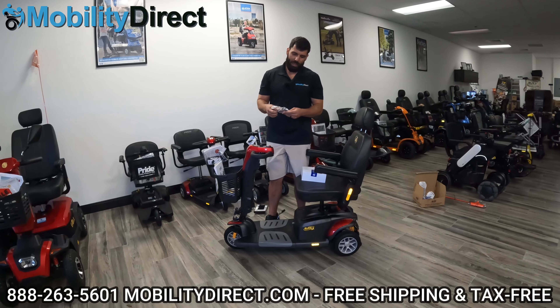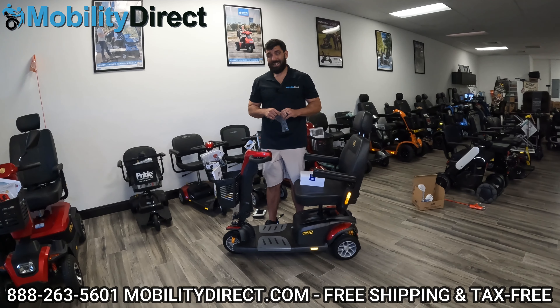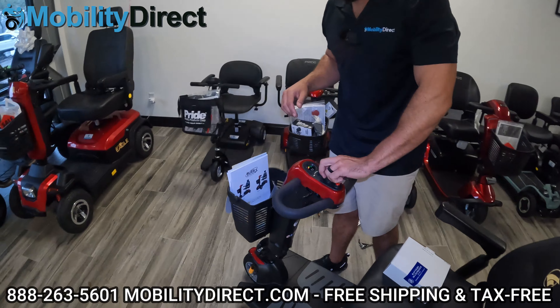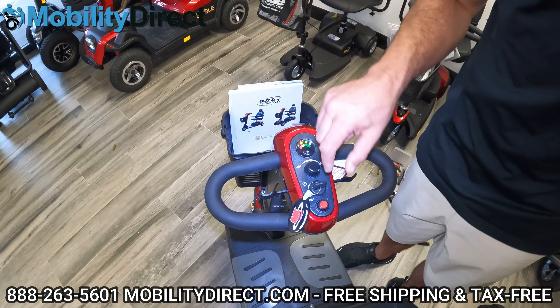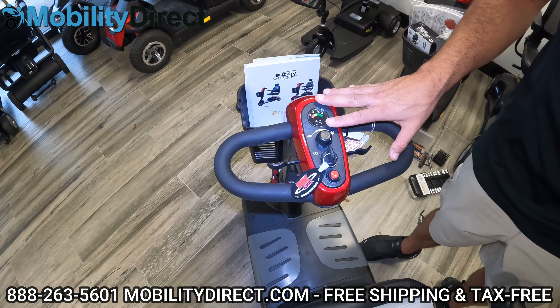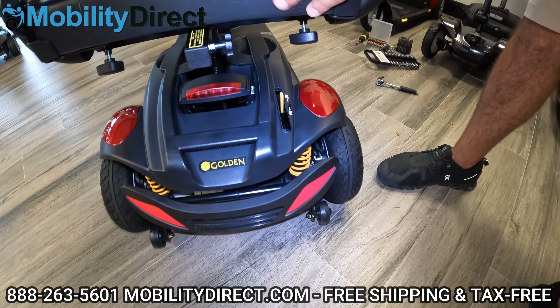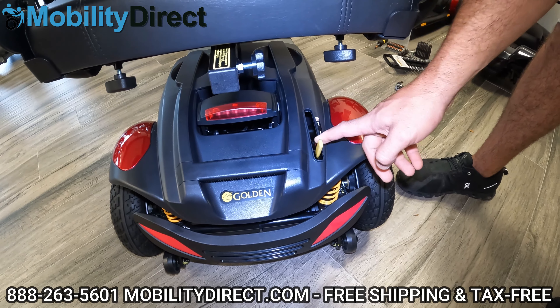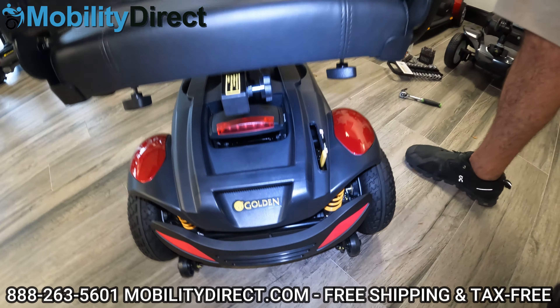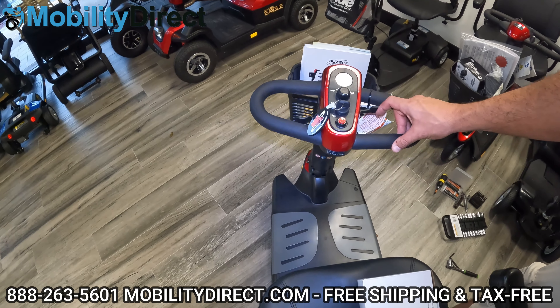Here are your keys — they come in a little bag and you get two keys. I'd recommend not keeping both on the same key ring: keep one in your car and one at home, or give one to a loved one in case you lose yours. To turn the unit on, put the key in the ignition. It's beeping five times — what does that mean? According to the user manual, it means the automatic brake is not engaged. So we'll turn it off. We rolled it out of the box in neutral mode. Put it back in drive mode so the automatic brakes are engaged, and then turn it back on — it's going to work just fine.